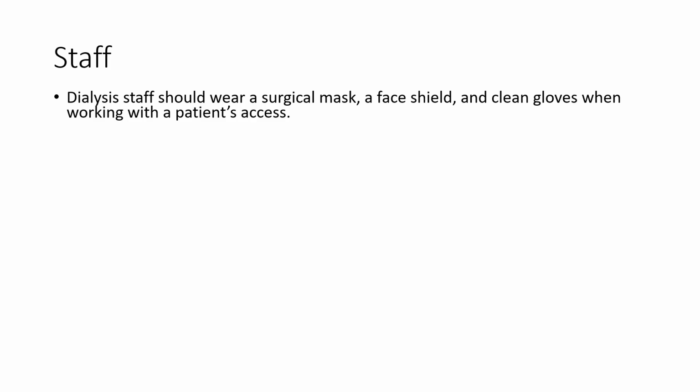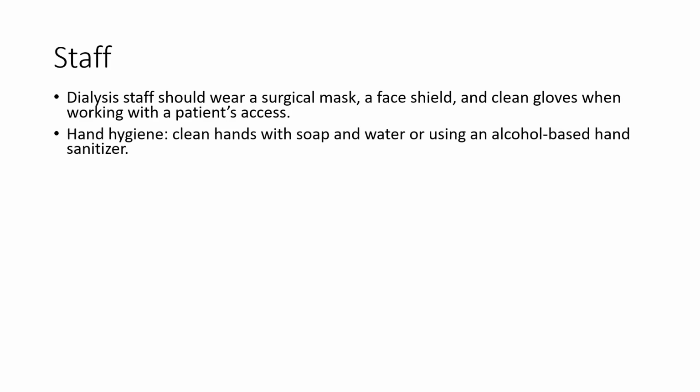Very important to wear a surgical mask, a face shield, and clean gloves when working with a patient's access. And of course, hand hygiene, the act of cleaning your hands with soap and water or using alcohol-based hand sanitizer is incredibly important. When should you sanitize your hands in a dialysis unit?